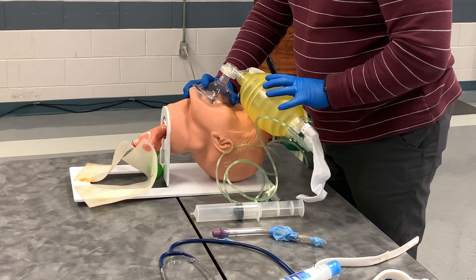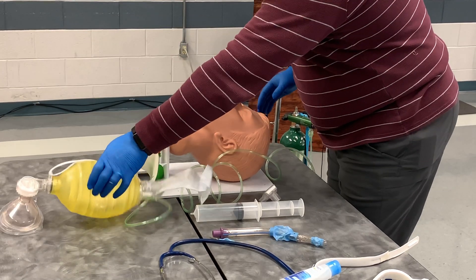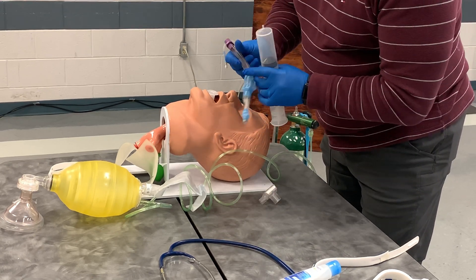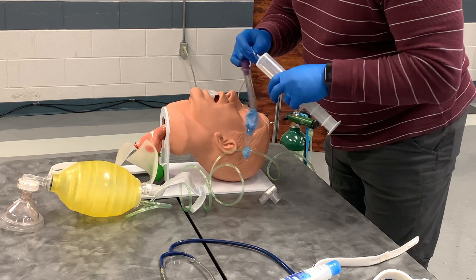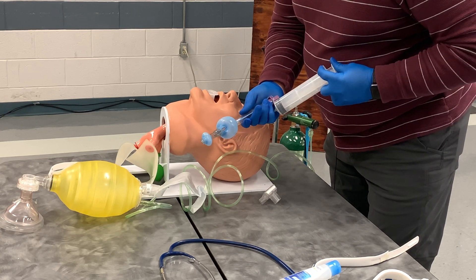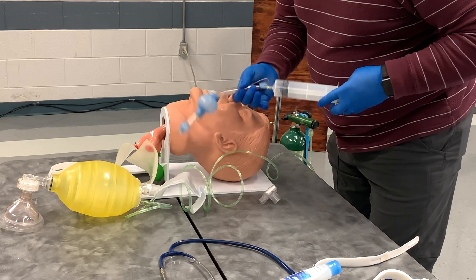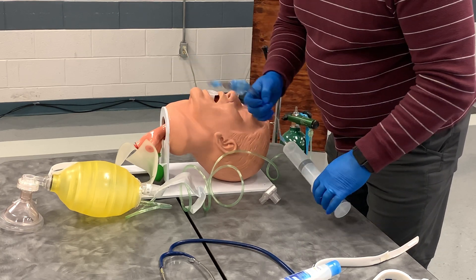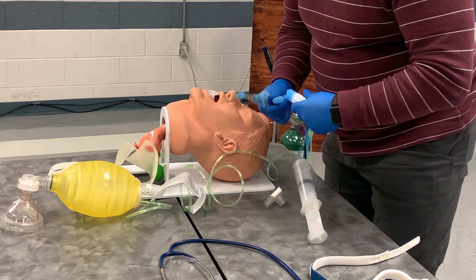Medical direction has said to insert a supraglottic airway, so I am going to turn my ventilations over to my partner and let him continue to ventilate while I check my equipment. I have the appropriate size King airway. I am going to attach my syringe — on the side of the airway it says 60 to 80 milliliters of air — so I will load that into my syringe and test the balloons. I can see they are inflating with no leakage and not going flat, so this one is ready to use. I will then remove the air and leave the syringe attached so I have it ready. I have my confirmation device and I am going to lube the tip of the airway.